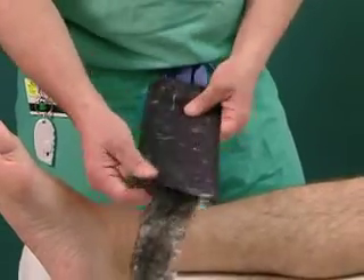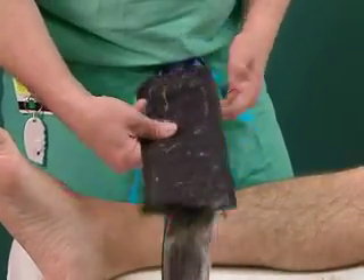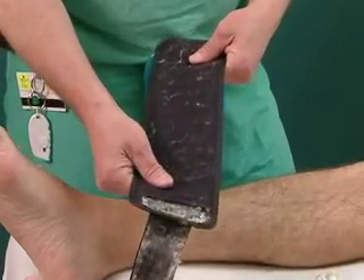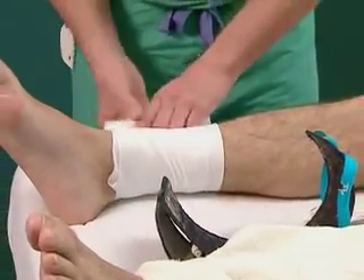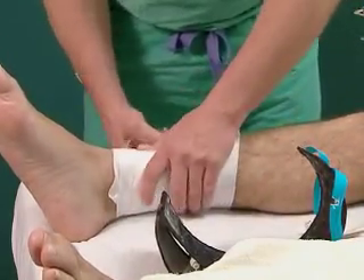When applying the cuff, be sure it's smooth. Wrinkles or tunneling in the cuff could damage the underlying skin and soft tissue. If the manufacturer's instructions suggest it, use a soft, wrinkle-free padding between the cuff and the skin for added protection.